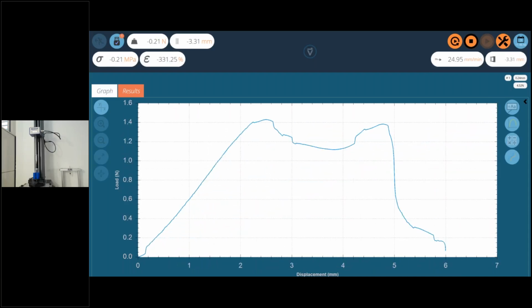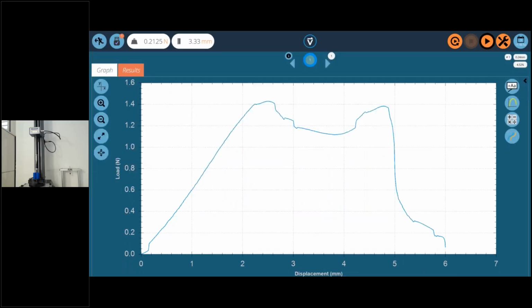Oh. Okay, so I'm glad it did that. So we've missed one step, did not tighten on the base fixture, but that's okay. That should at least allow us to demonstrate one part of a missed test. SOPs indicate that we need to tighten down on the fixture to prevent it from moving. So here we are. That was test number 1.